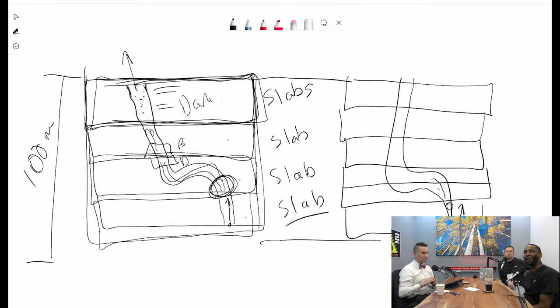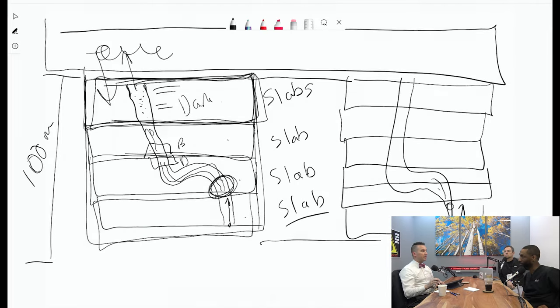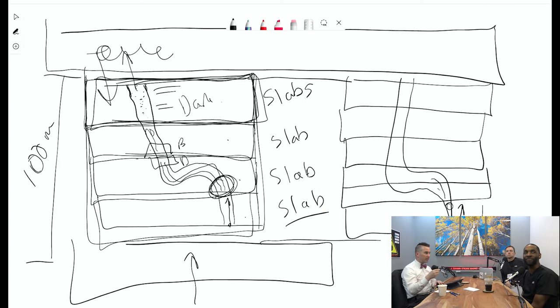Now, how are we preventing venous flow coming in? Above the slabs, we are putting sat bands. In this case, venous blood is coming down, but that spatial inversion sat band makes it so those protons that are flowing in are saturated. If we wanted to see the venous and get rid of the arterial, we'd just switch that. The venous, we'll talk about, is really good to use in 2D time of flight. But if you did want to use a 3D technique and you wanted venous instead, just swap the sat bands and put it down inferior. So all arterial blood that's flowing in is saturated, and all this venous blood flow is not, and it's flowing back down.